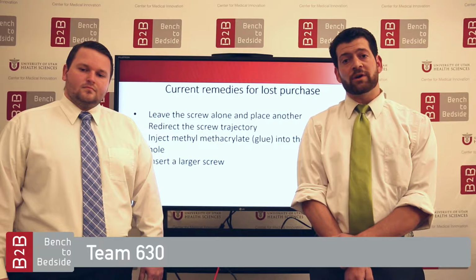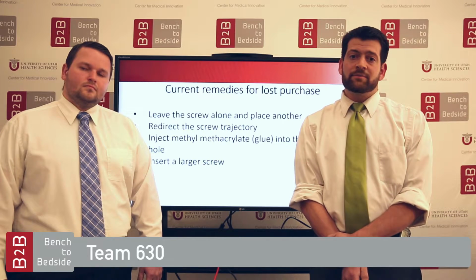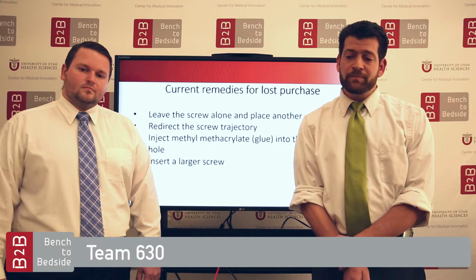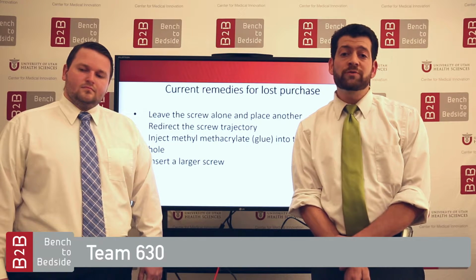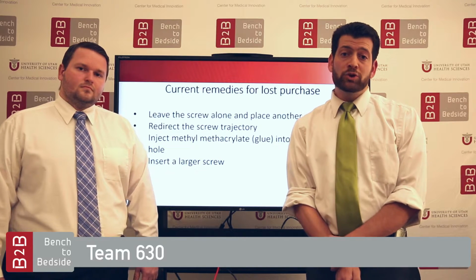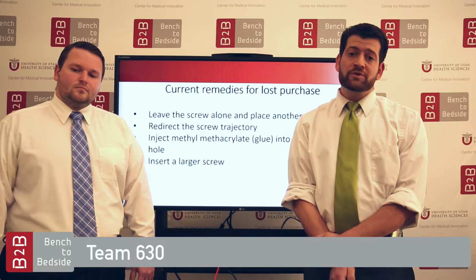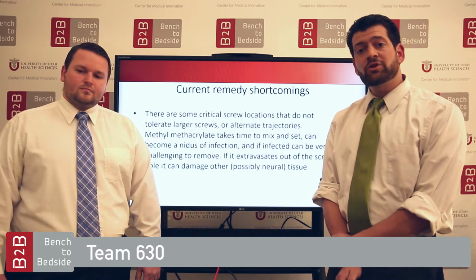Currently, the remedies if you lose purchase would be to leave the screw in place and simply put in another screw. You could try to redirect your trajectory. You could remove the screw and inject methyl methacrylate, a bone glue, or you could remove the screw and insert a larger screw. There are some shortcomings to this.